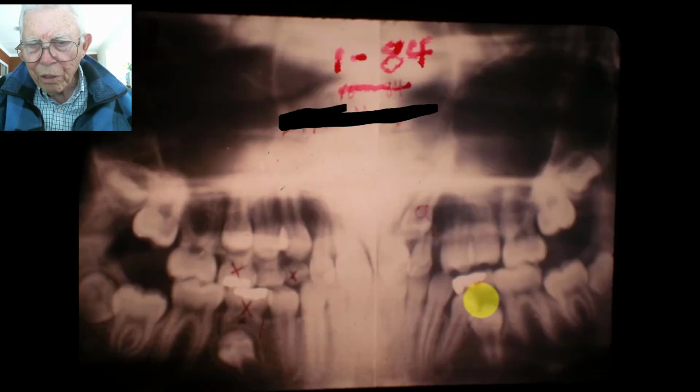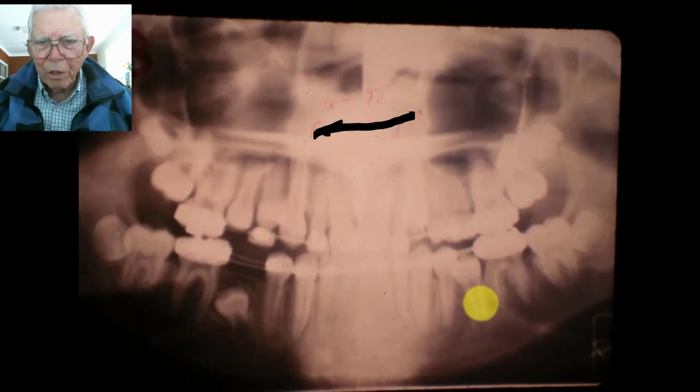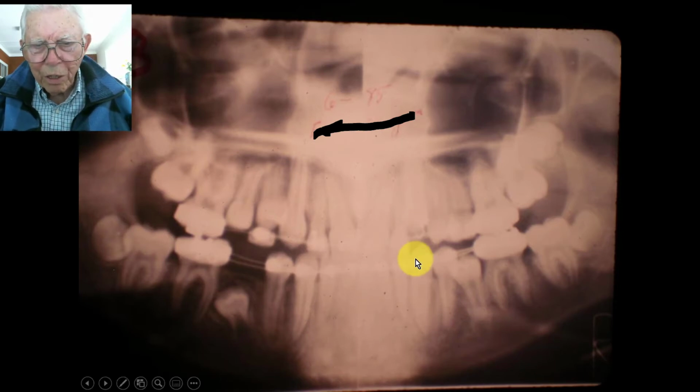We're going to have to get this tooth removed here, and that flicks back on us again. All right, we'll remove that cuspid, the second bicuspid down at the bottom, and now you see the cuspid tooth is right over the central at this point.